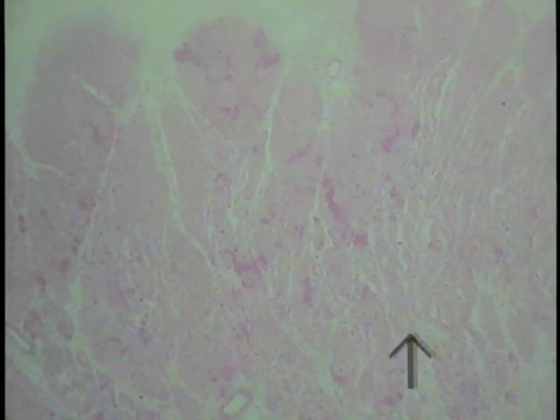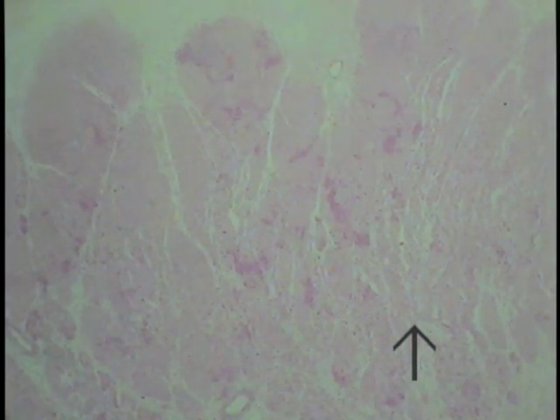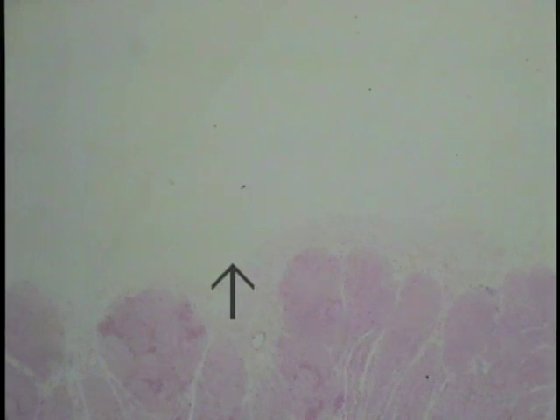The connective tissue seam, shown here, will contain elements of the myenteric or Auerbach's plexus. And then finally, we get to the more exterior part, the second component of the muscularis externa, the outer longitudinal layer, which also is considerable in its depth. And finally, though very light on this particular preparation, but nonetheless there, a very thin adventitia that is going to anchor the esophagus to adjacent structures.